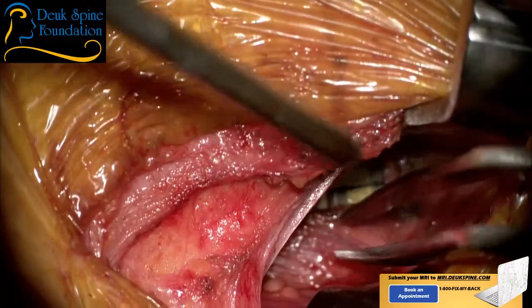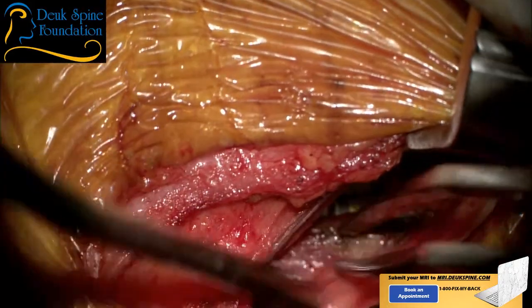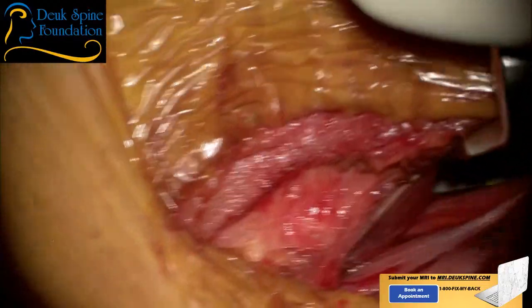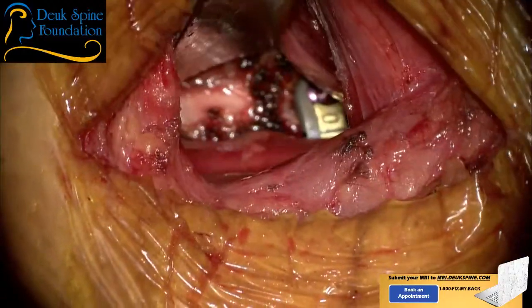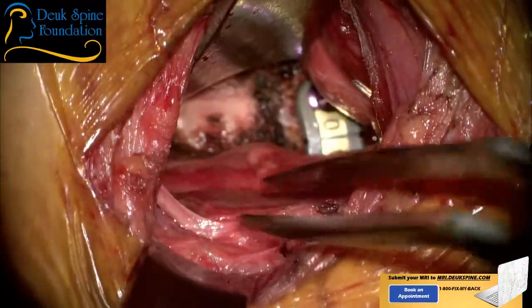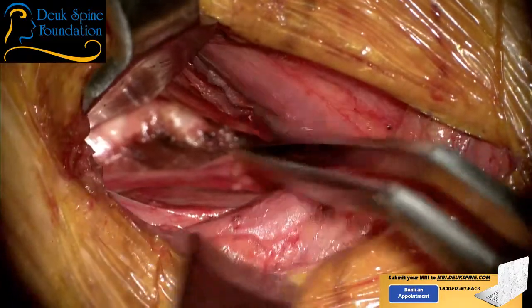I'm terrible at golf. All right, you see the little vein there? That's the kind of stuff that will bleed at 2 o'clock in the morning. So you want to make sure you get it now. Now, that's very nice. Now, let's look at the walls. Let's slide up the walls a little bit, Patel. Just show me the walls here. They're looking pretty good. I don't see any active bleeding. There's a little branch of the ansa cervicalis right there. A little bit of disc material. I mean, it's looking good, huh?